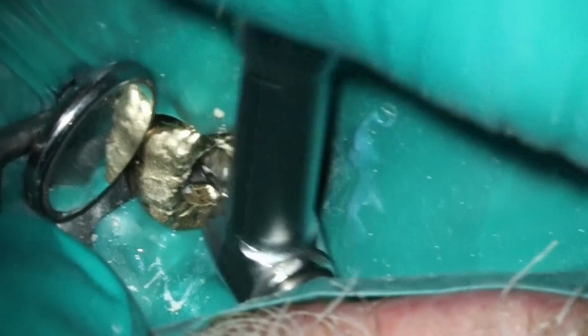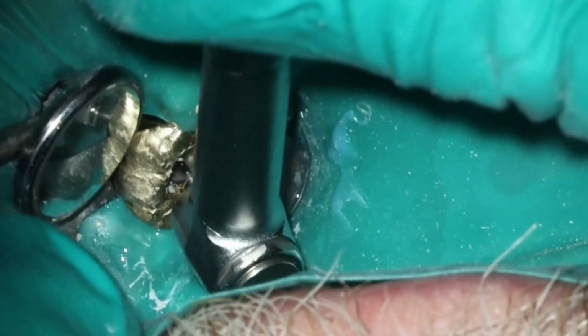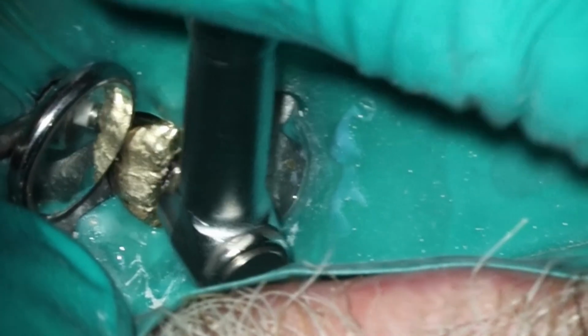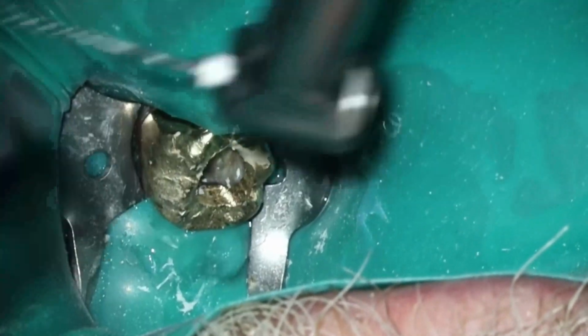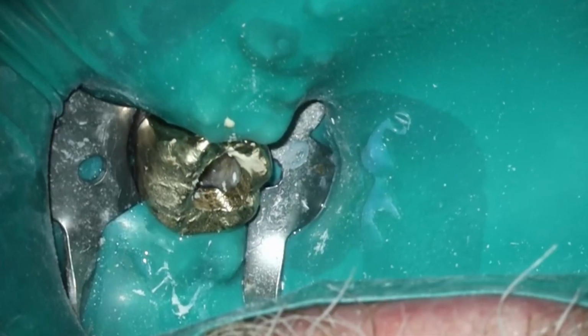I'm going to use the rotary file pretty much as my file to carry the sealer to the apex. So if you're trying the squirt technique and you've had some difficulties with getting patent or getting to the proper length that you've measured, and you've tried a 10, a 15, a 20 K file, nothing's working, try a rotary file. Sometimes a skinny one, do a 14 or a 17, depending on your comfort level, and see if that will help. I have to do this maybe once a month, maybe once every other month, but it's just one of those good skills to have in your back pocket.